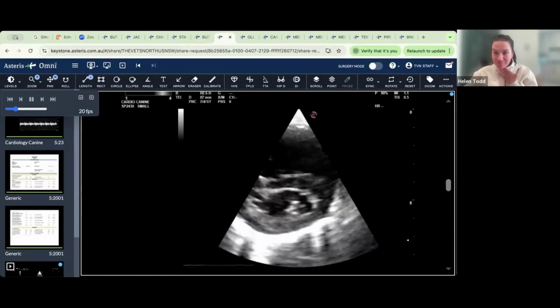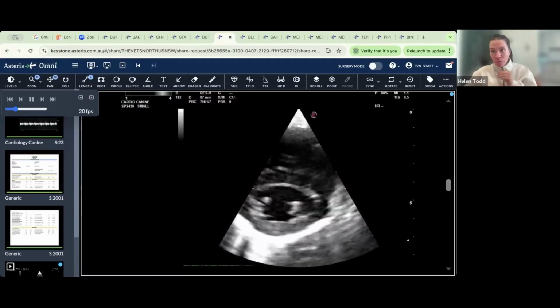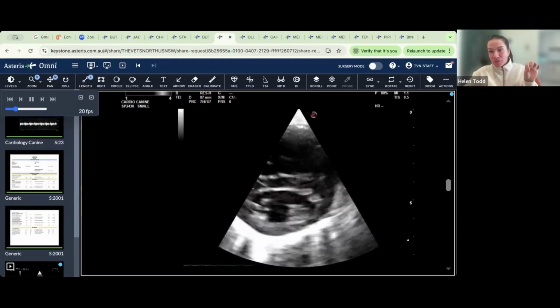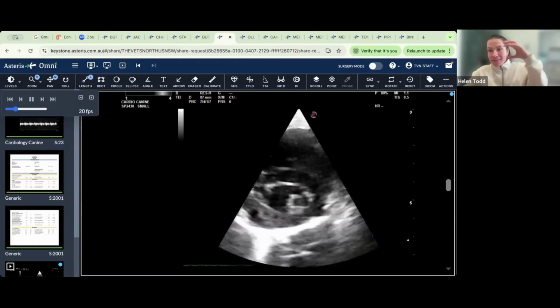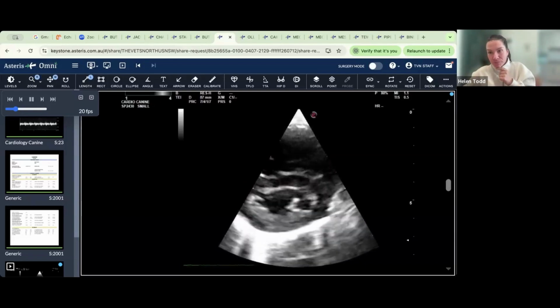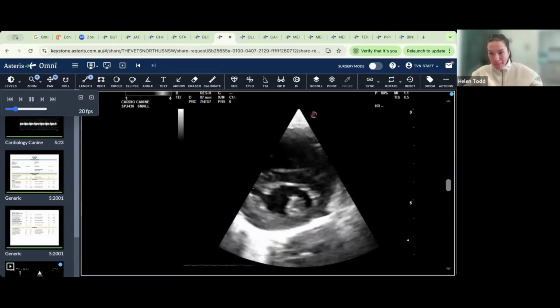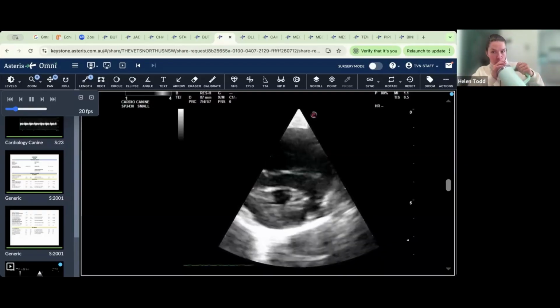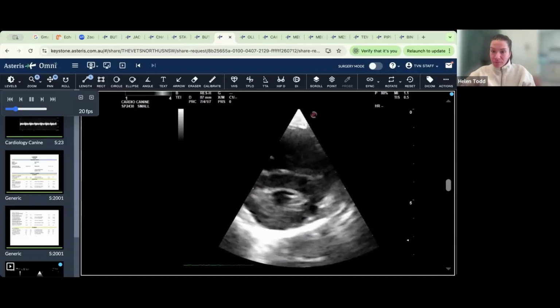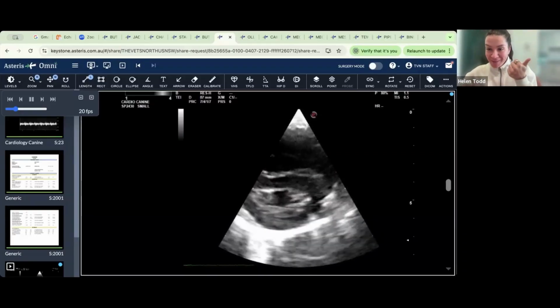Yes. We've got flattening of the intraventricular septum, which turns this view from what we'd call a mushroom view into a bit of a Tesla sign. Do you guys see the difference in that? Instead of being this nice rounded mushroom, it's almost flattened to look more like the Tesla logo. What would flatten that interventricular septum, Carly? Like pulmonary hypertension. Yeah, absolutely. That could absolutely be one differential, and that is the differential in this dog. Well done. It had pulmonary hypertension.